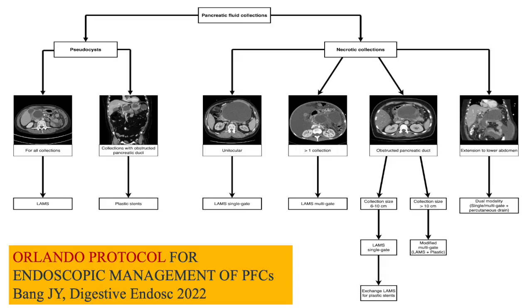We hope that this Florida Live educational video has impressed upon endoscopists the need to be proficient with plastic stent placement under EUS guidance. This technique will be demonstrated at Florida Live by Professors Takao Itoi and Pierre Deprez.